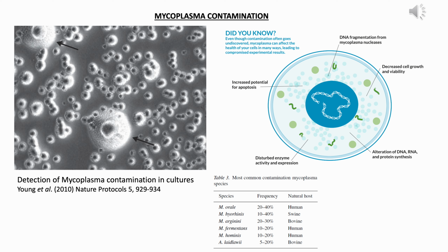It's very difficult to get rid of these mycoplasmas once your lab is infected. And one cannot detect them also. So if we have mycoplasma contamination and we continue to do our experiments, then we don't even know whether our results are actually accurate or not. And many of the results that you had established early on may no longer be working.